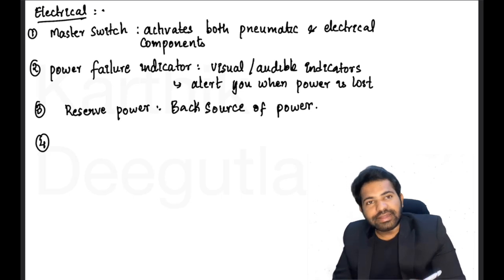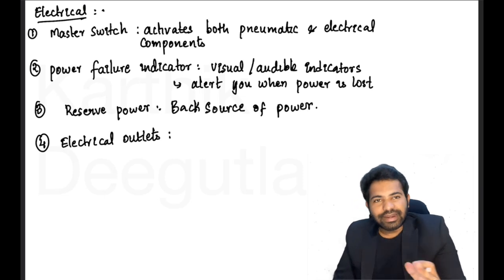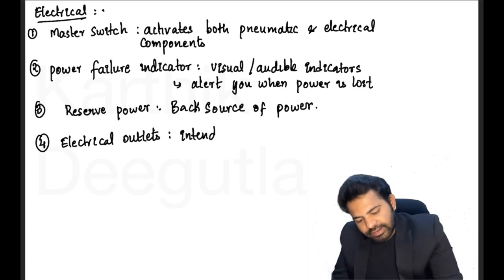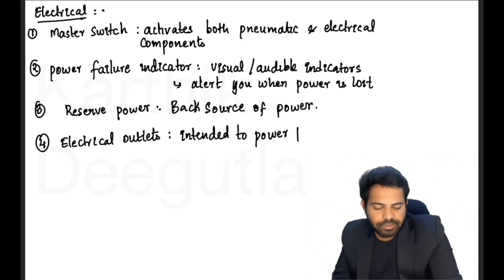So the fourth thing is electrical outlets. These electrical outlets are intended to power the anesthesia monitors.